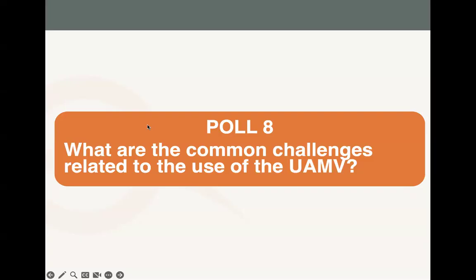It's a smart device. So if it's not regularly calibrated or checked, it tends to give you errors as a result of not regularly following the steps before use. So it's very important that we take our time to do the machine check, and we also make sure that those devices that need calibration, such as the oxygen analyzer and the flow sensor, are also attended to.